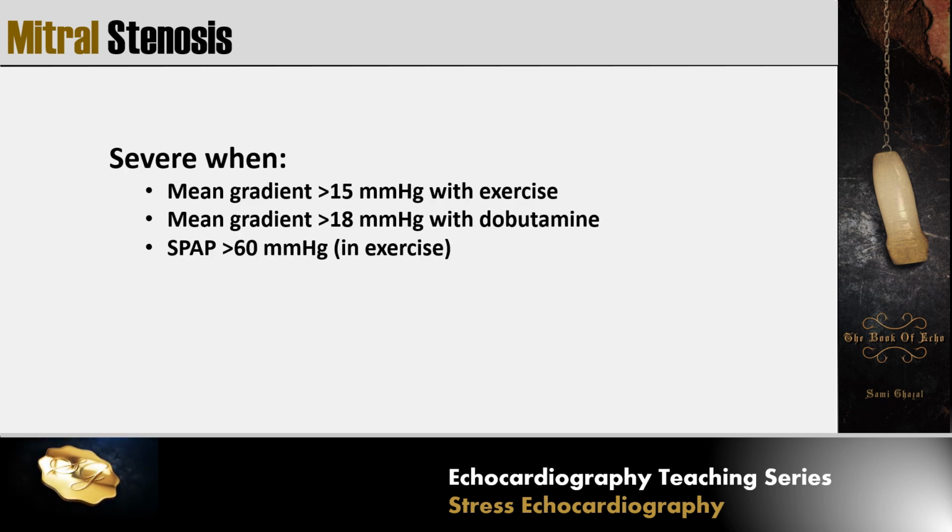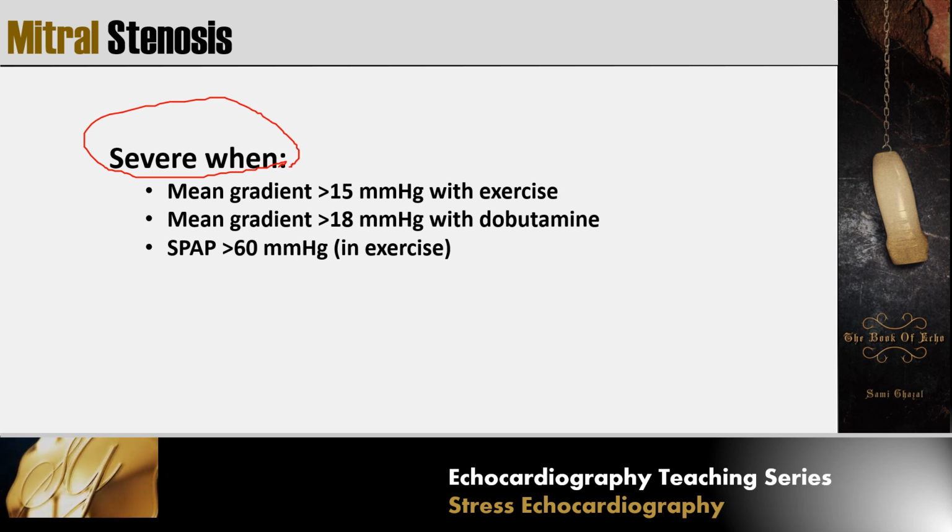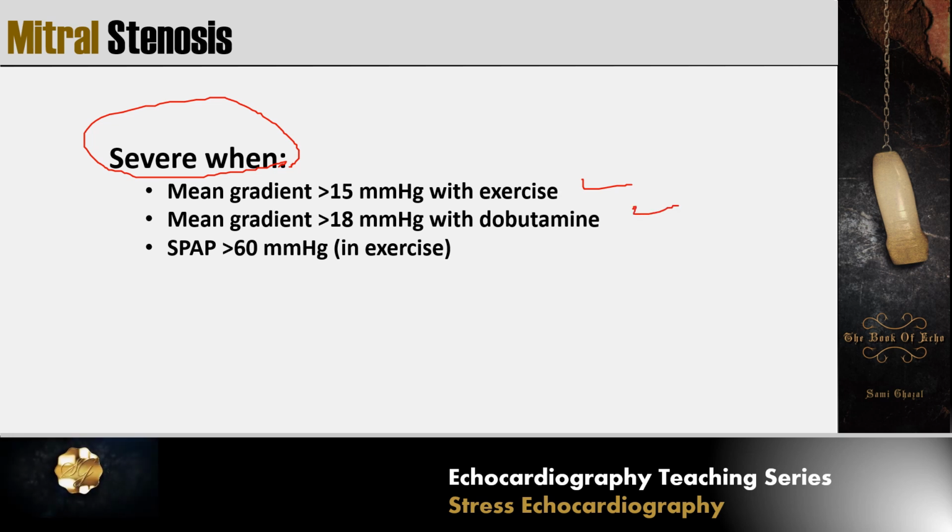We call, or we regrade, mitral valve as severe when the mean gradient is more than 15 with exercise or more than 18 with dobutamine, and systolic pulmonary arterial pressure more than 60 with exercise.